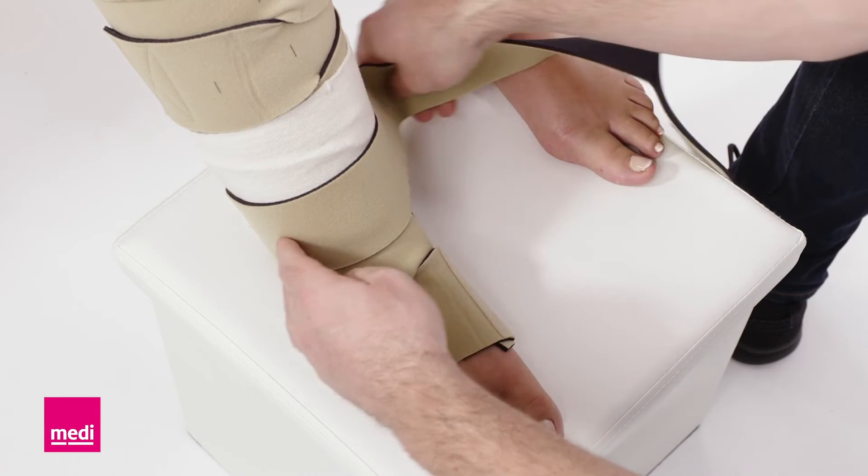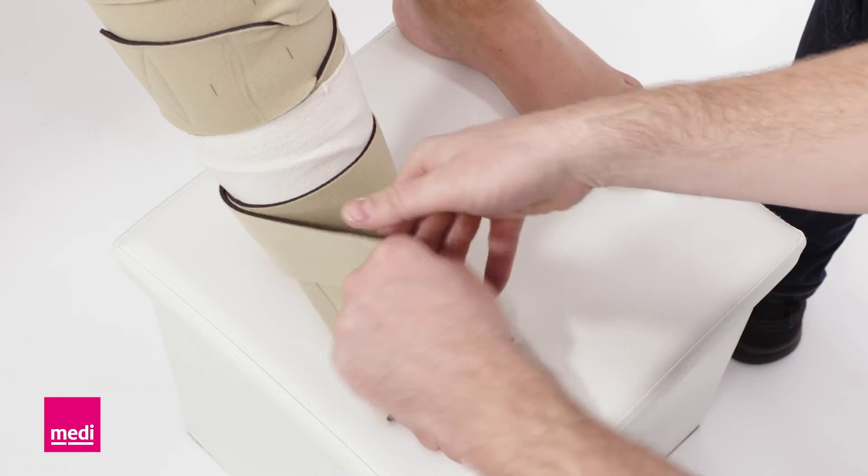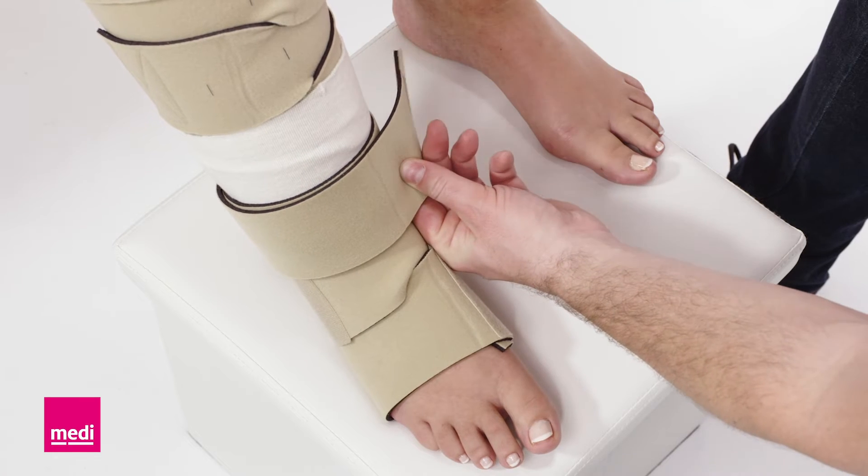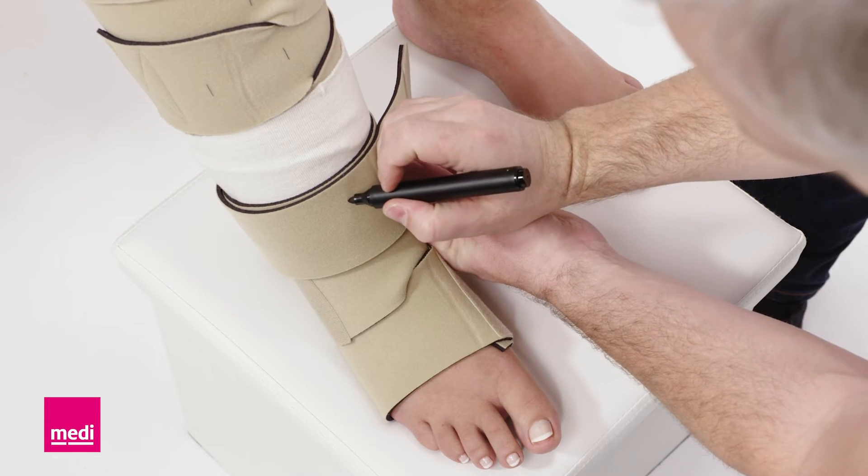Take the ankle band and put it around the ankle. The band should overlap with the lower leg garment. If necessary, you can also trim this band.